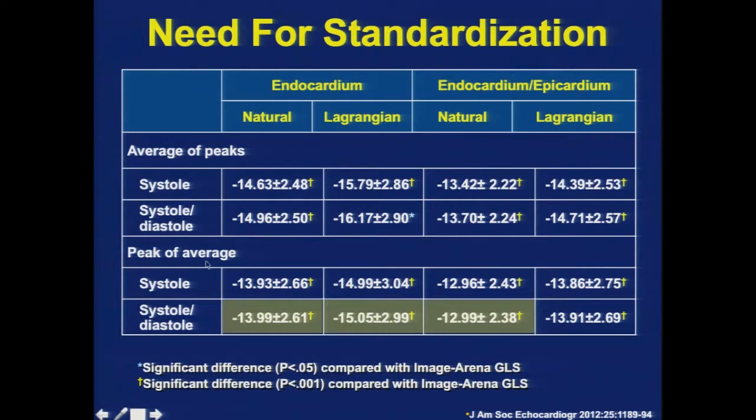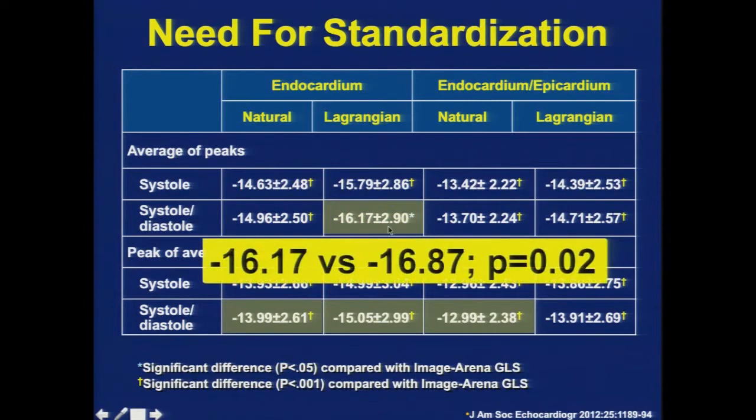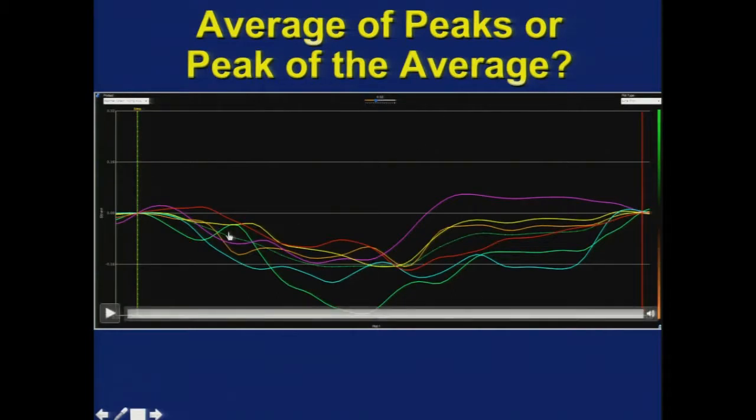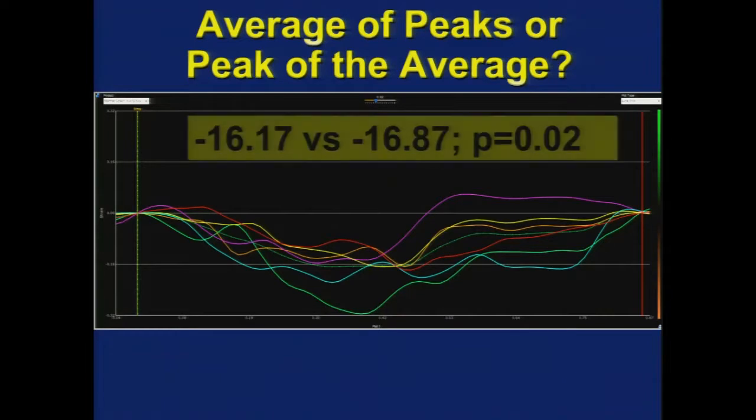One looked at the peak of the average curves and the other looked at the average of the peak curves. If we corrected for that, the value went from 12.9 to 16.17. So now the values, although statistically a little bit different, were much closer. I just wanted to share with you the average of the peaks or the peak of the average. Here we see 6 curves, and in the middle there's a little dotted curve, which is just the average curve. You could measure the peak of the average curves, or you can average the peaks of all the 6 curves, and you're going to get a different value. So simple things just simply need standardization.